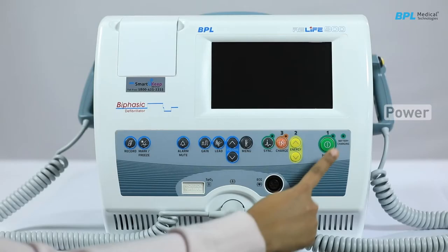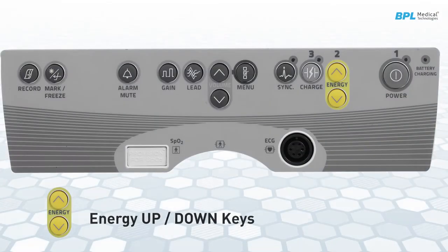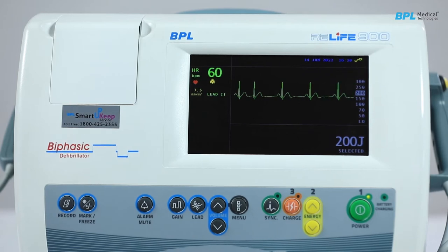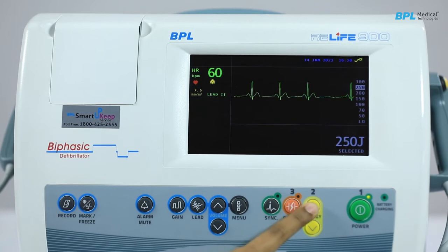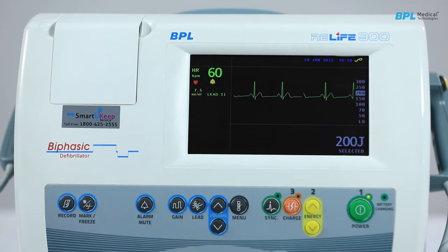Power. To switch on the defibrillator, press the key once. When switched on, the LED located in this key is illuminated. Energy up-down keys. When any of these keys is pressed, a menu appears on the screen indicating the various energy levels. Pressing the up key selects the next higher level on the menu. Pressing the down key selects the next lower level on the menu.